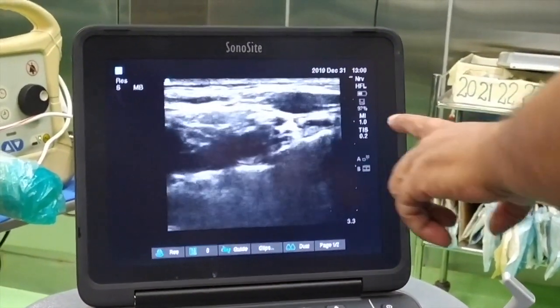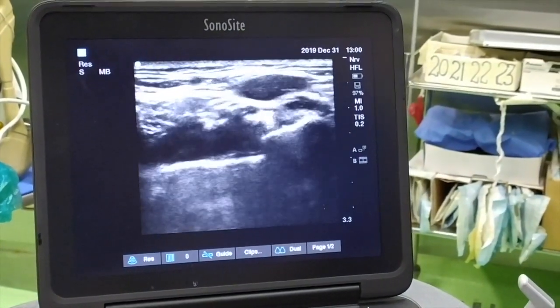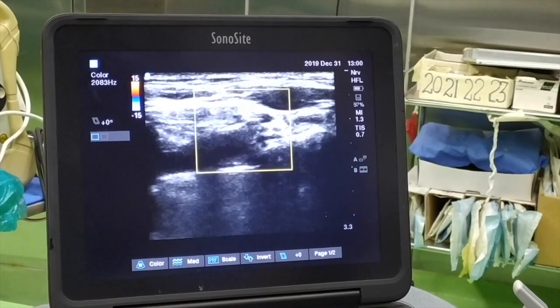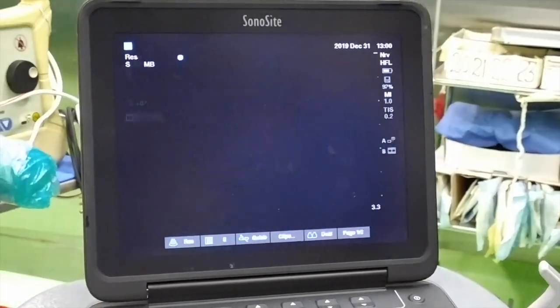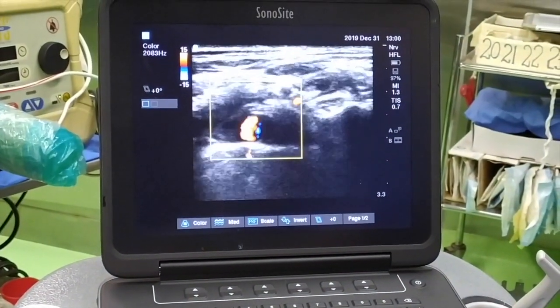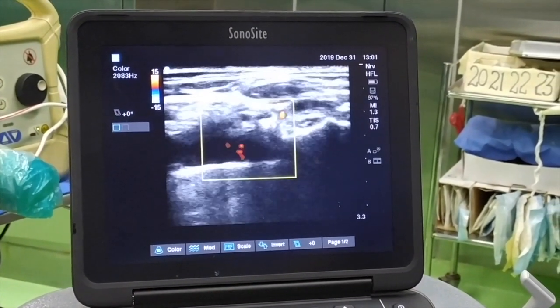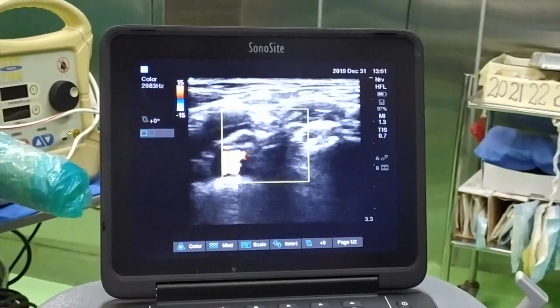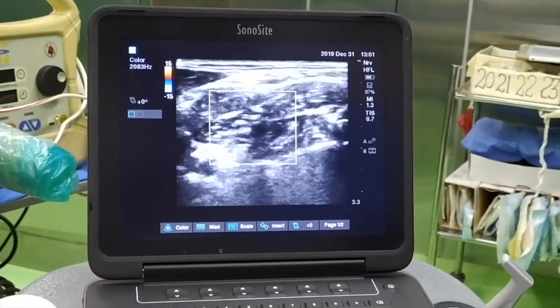We should look to see any vascular structures in between our needle path. We should always put color Doppler over our block area. Here we are doing color Doppler of that area, and we have found that there is one vessel when we will insert a needle laterally around the brachial plexus. So I am scanning proximal to identify it — it is a branch of the subclavian artery, specifically the dorsal scapular artery.